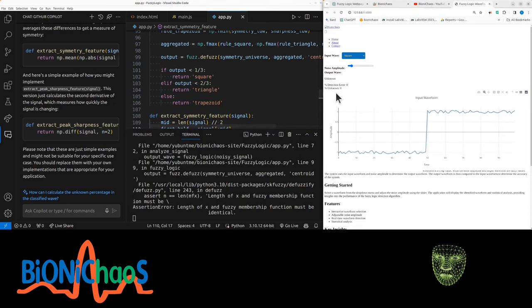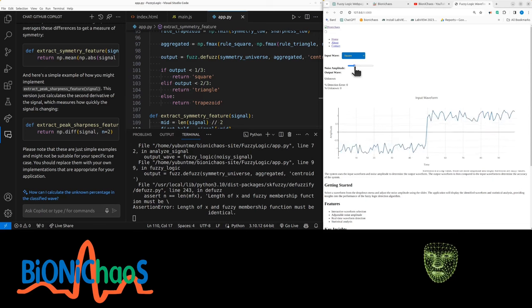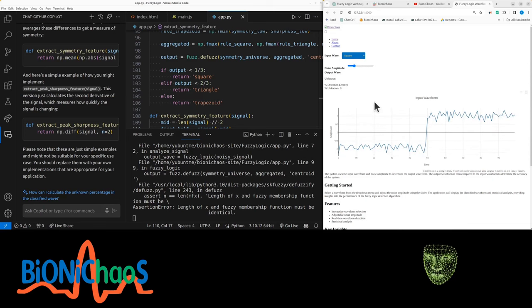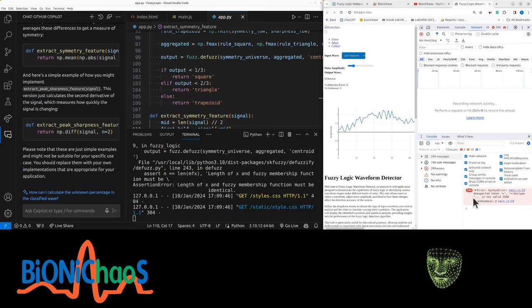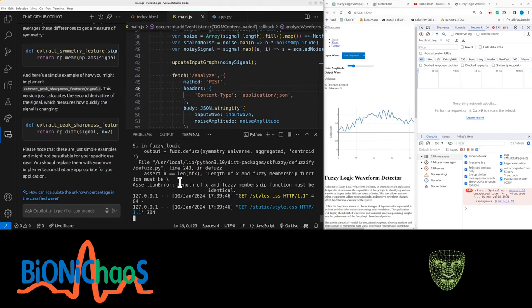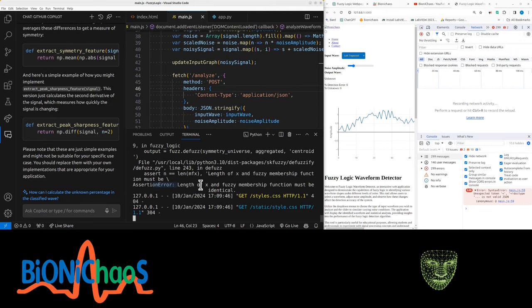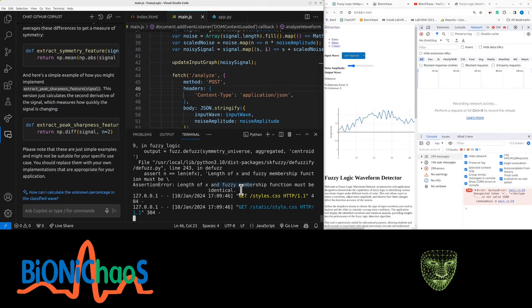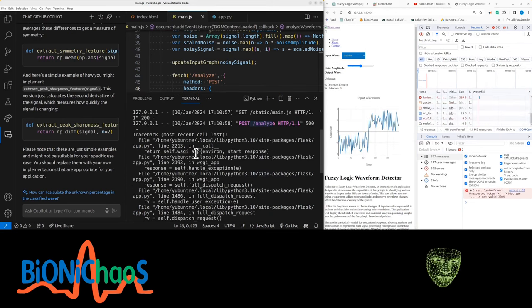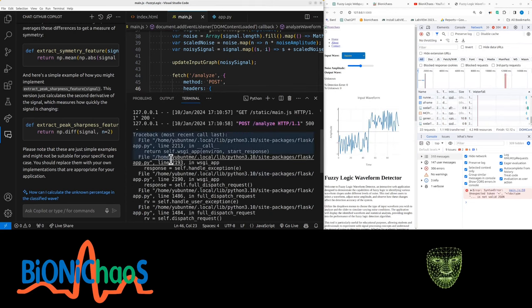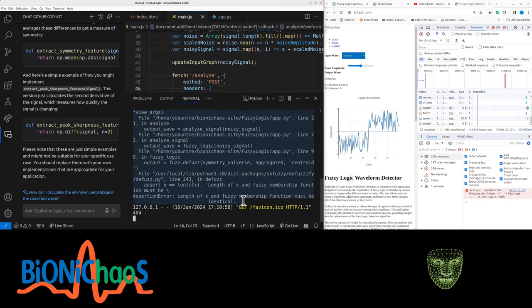So currently this is what we have running. It's giving us unknown. Certain noise works. Okay, get an unexpected token. The JSON file is not valid. Right, get an error in the backend as well. Length of X and fuzzy membership function must be identical.